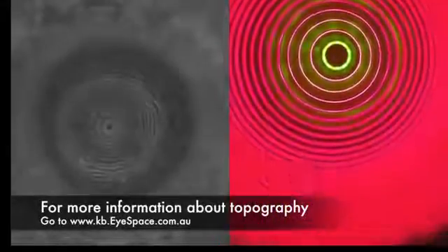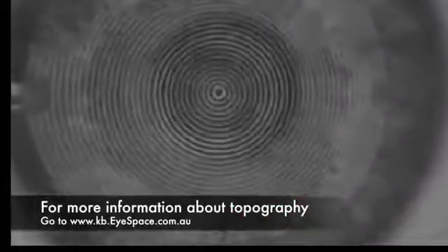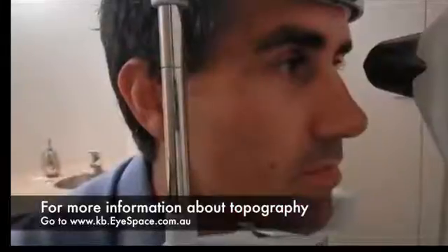Accurate corneal topographical capture and assessment has become a requisite in all busy contact lens practices in recent times, and will shape the future of clinical practice.